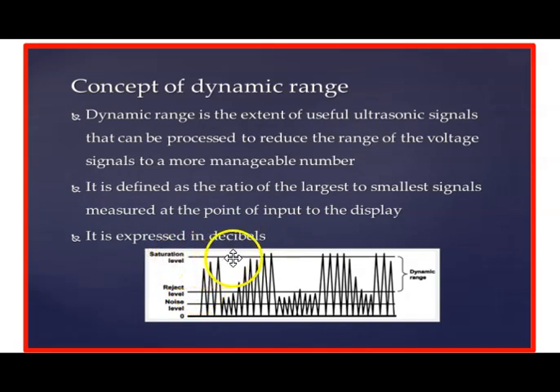And here you can see where this box is determining that the machine rejects a certain amount of images below this line and accepts images above this line. That rejection and acceptance determine the saturation level of the screen and the shades of gray, and how dark or bright they're going to be.